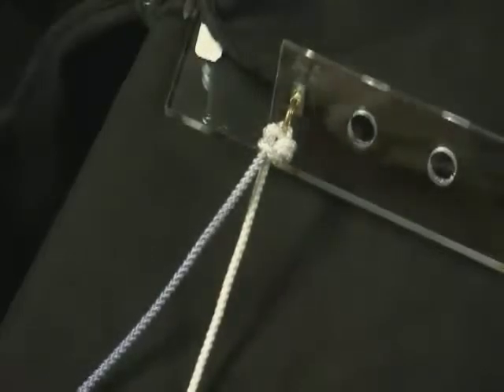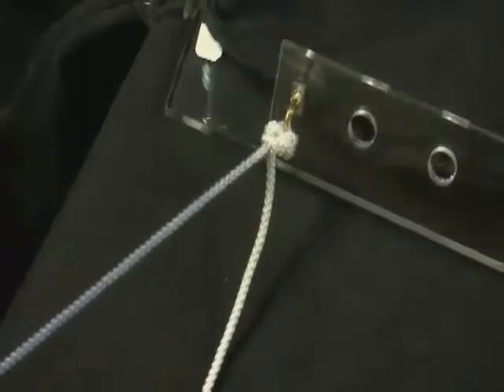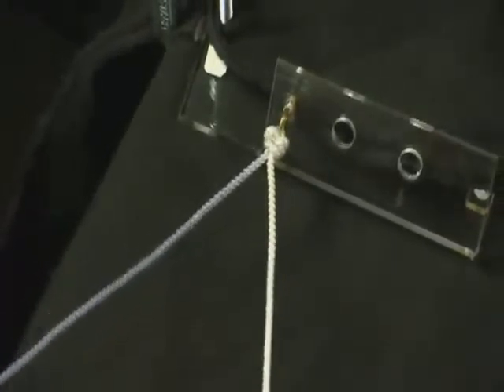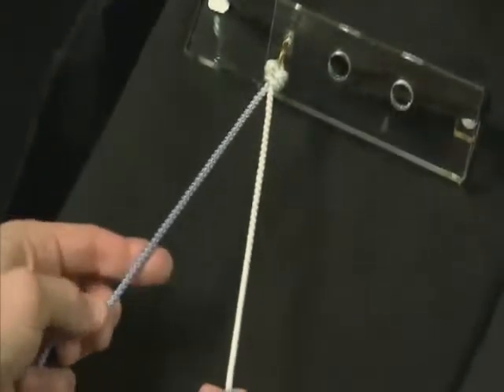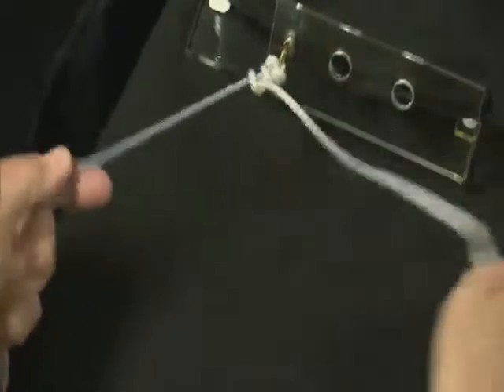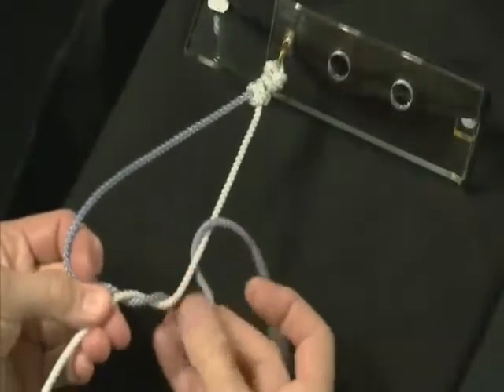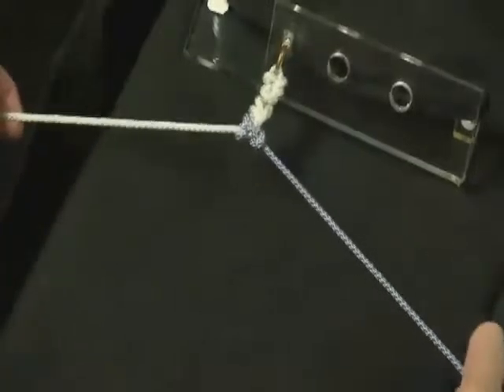You can certainly use a knot pusher if you want to. You want to put the tension on the post, and you can seat it. To flip it, all you do is pull on your wrapping limb, and that locks the suture. So this is a sliding suture, and now it's locked. You do want to put half hitches on it, but you don't have to worry about knot security. With half hitches, go over and under on one limb, then switch to the wrapping limb and go over and under. And there's your finished knot.